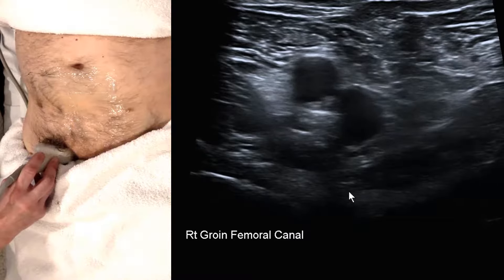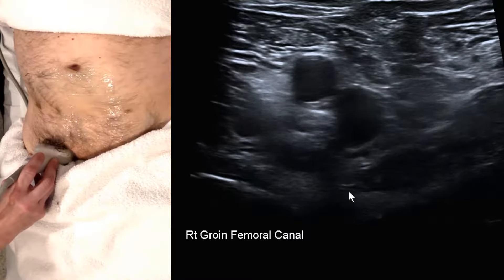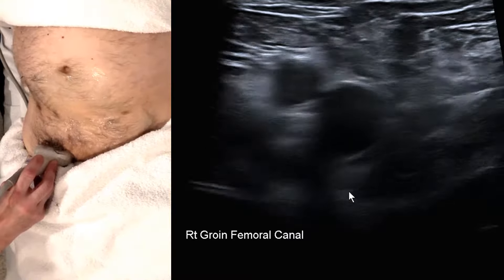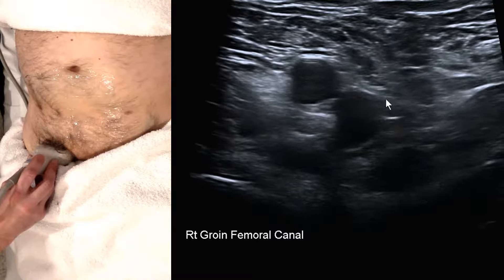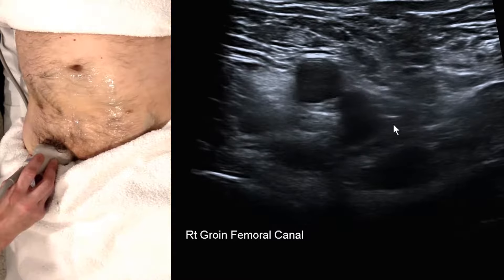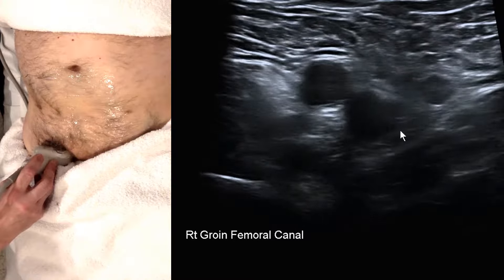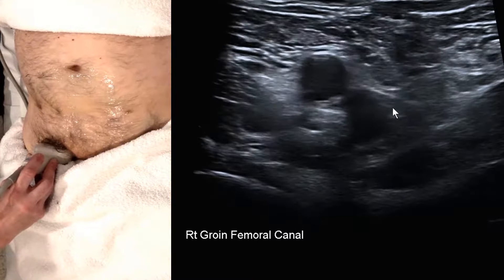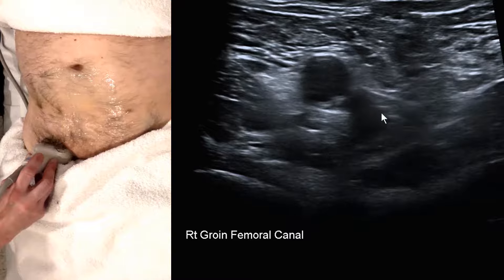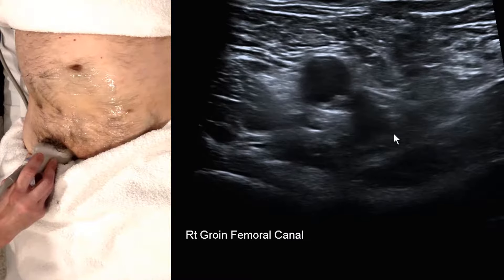If we're at the level of the inguinal ligament, we're too high. So we ask the patient to distend the abdomen, to balloon, to Valsalva, and we look for movement medial to the vein.